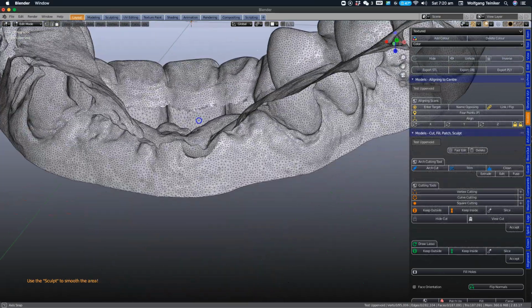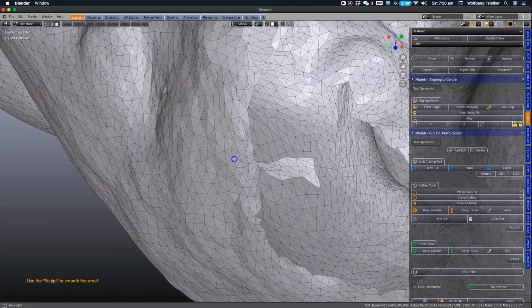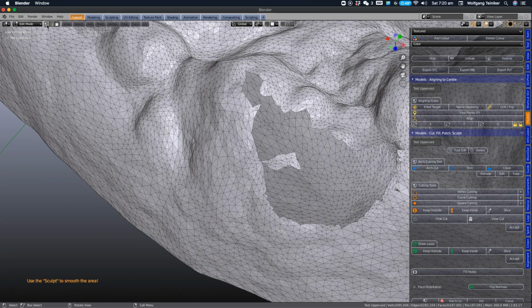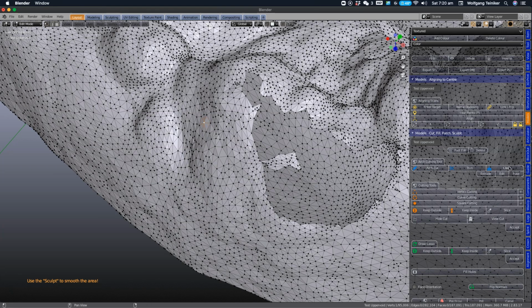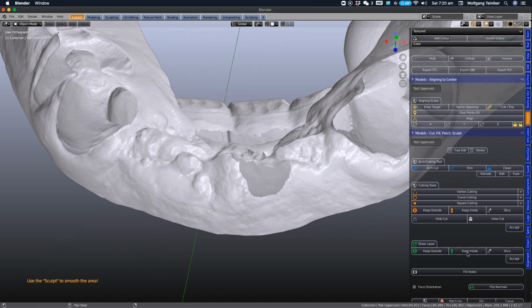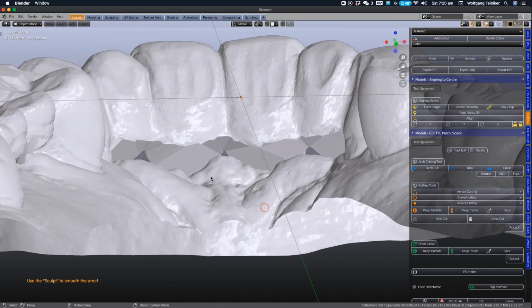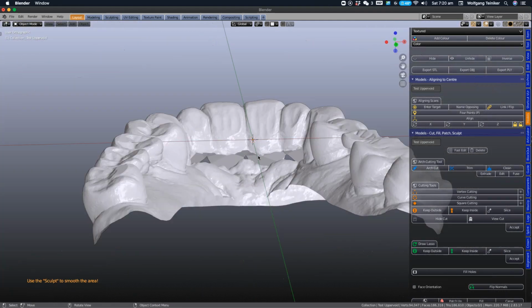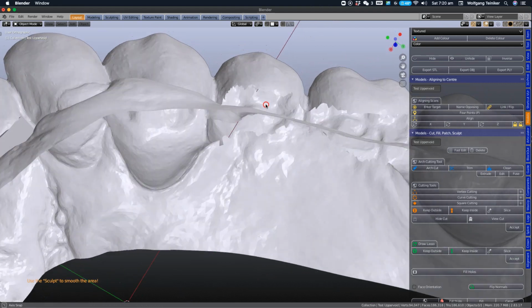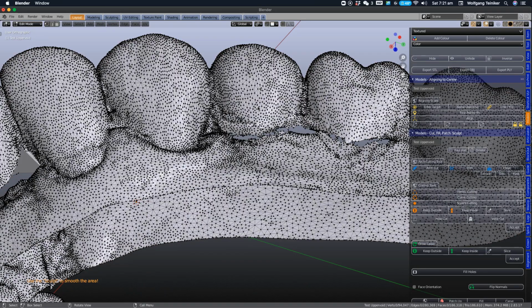Now we can try and, this hasn't gone yet, so there's still a small connecting piece. No, it's free floating. So what that means is we're going to clean the mesh, so it's going to get rid of small fragments. After this, I'm going to just press the fill holes button. So that's plugged the gum. It has also plugged the pontic area, and it has not plugged this section because we need to connect that onto the gum. So the way we do that is we go into edit mode.